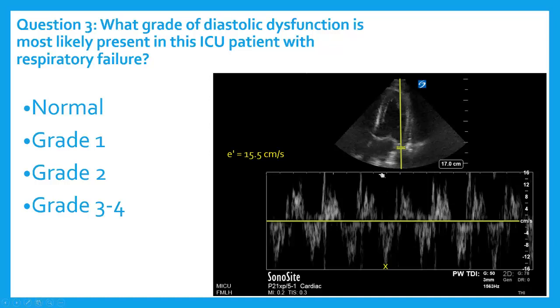Here's another question: what grade of diastolic dysfunction is most likely present in this ICU patient with respiratory failure? I've only measured one thing — a lateral E-prime velocity. I've got my sample box right over the myocardium at the mitral valve annulus in the lateral wall in a four-chamber view. So is this normal, grade 1, grade 2, grade 3, or grade 4? It's normal — I have an E-prime velocity that is well above 13. That is a vigorously relaxing left ventricle.